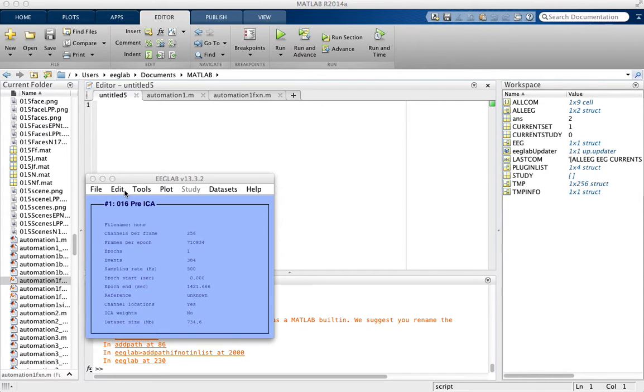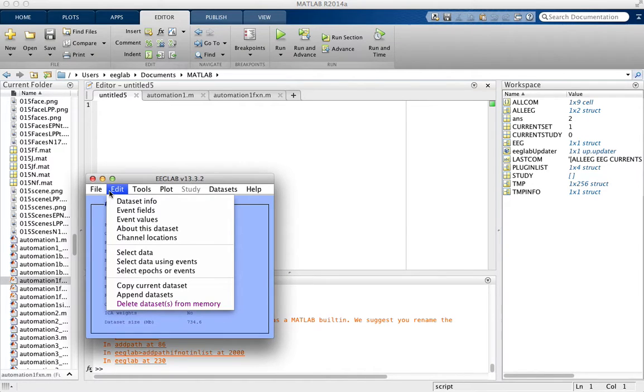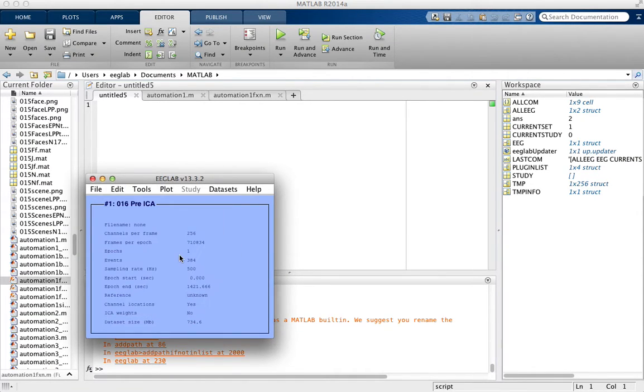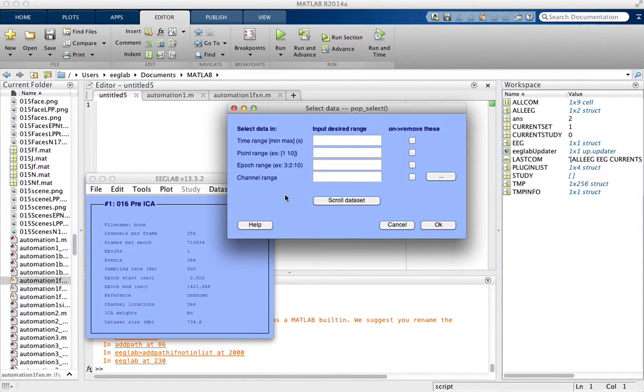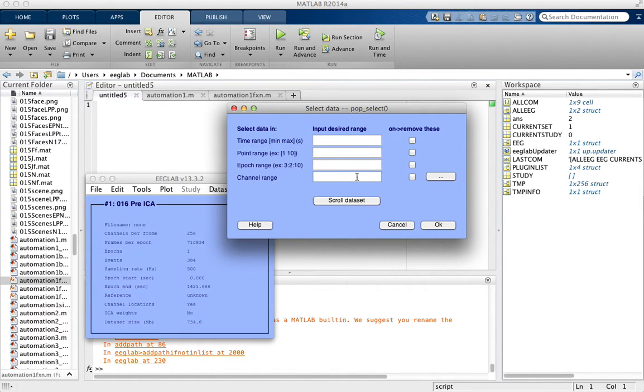So in order to do that, click Edit, Select Data, Channel, and we're going to be looking at this line, Channel Range here.